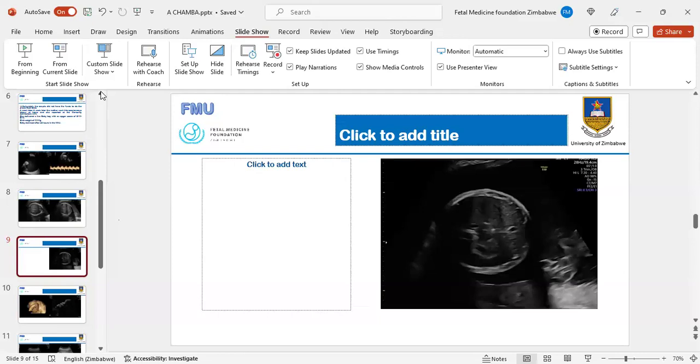So it is important for the baby to be thoroughly checked to make sure there is absolutely nothing else on the baby. Once you don't find anything else, then you go to your Dopplers. If your Dopplers are abnormal, then you are certain that you are dealing with a placental insufficiency condition, and that is your primary FGR diagnosis. So please take note of this.